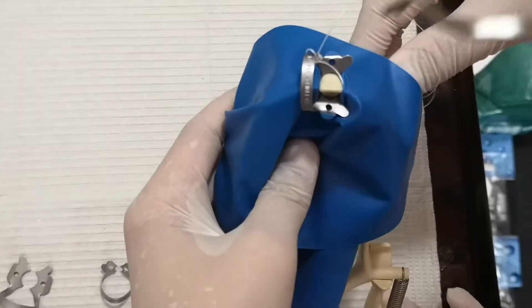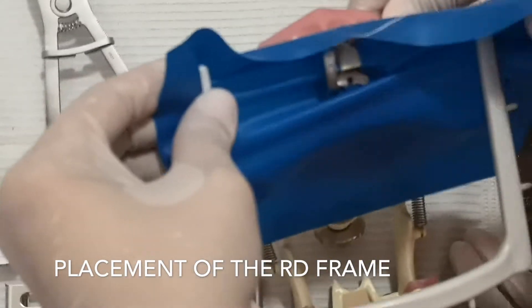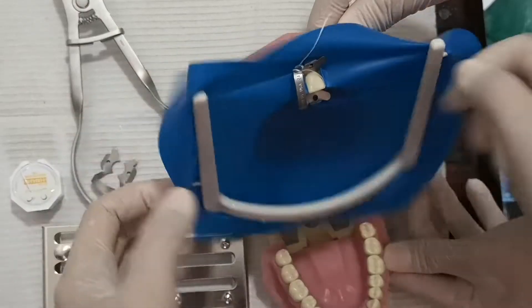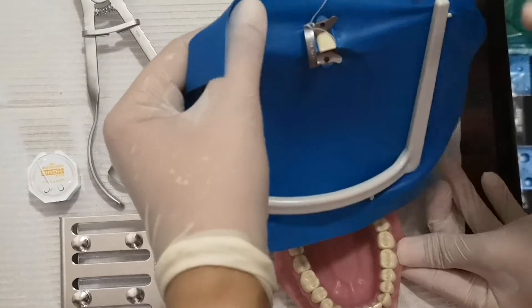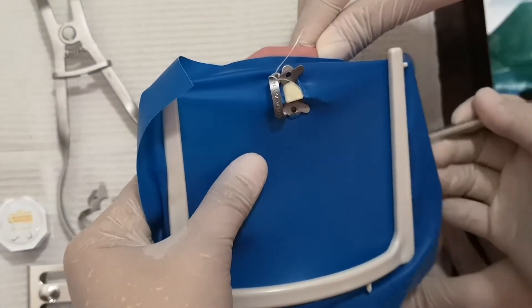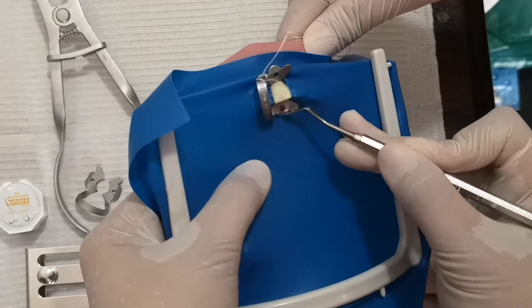Place it labial and then lingual. Get your rubber dam frame — attach from one side, then the other side, then the middle, then another side, and then the remaining hook. You still have to do the last part, which is to tuck this in using your Woodson plastic instrument. If you do not tuck it in, what happens is there is a hole and saliva can get through, so you won't have any isolation.